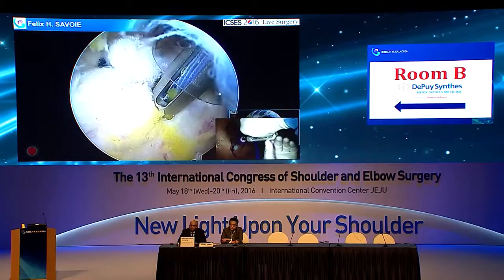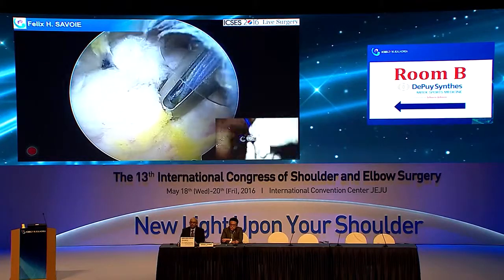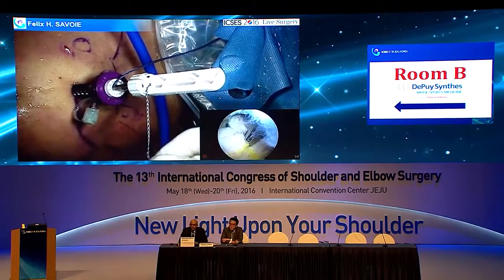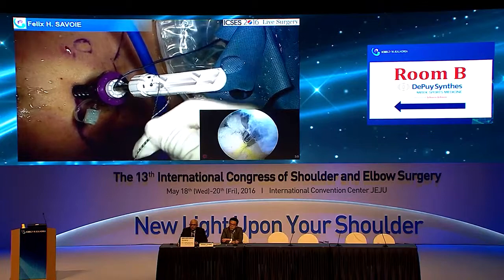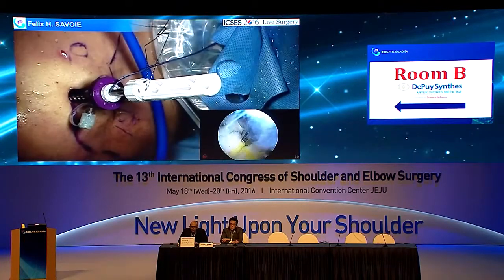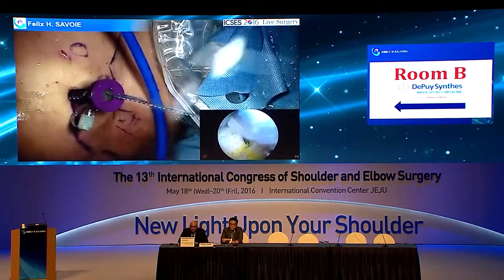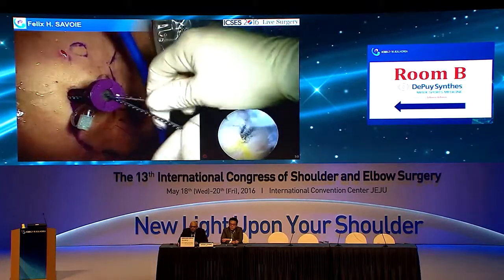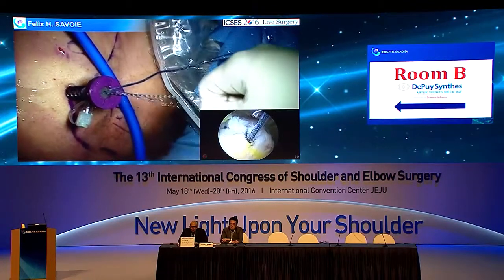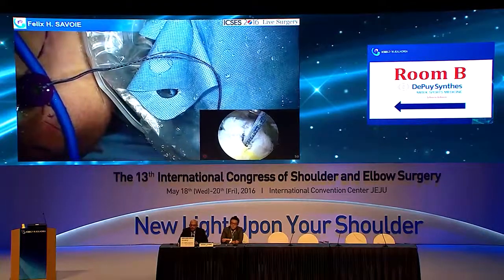Now, if I needed to, I can use those sutures, or I can use this suture on the inside. So I could use these sutures on the outside and pass them again if I had a dog ear or something I wanted to fix. I don't, but I could. And so then we just take this out. I think it was this one, wasn't it? We'll just get rid of this suture because we don't need it. And we'll cut these others.